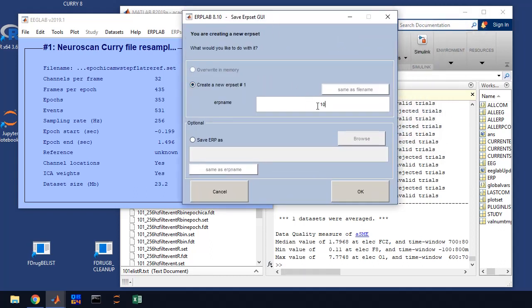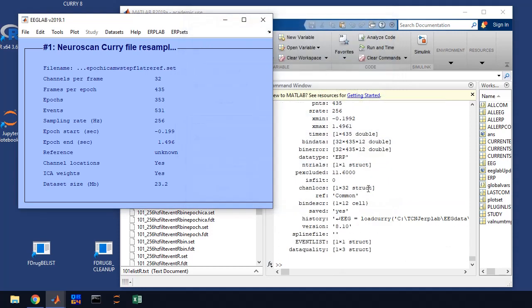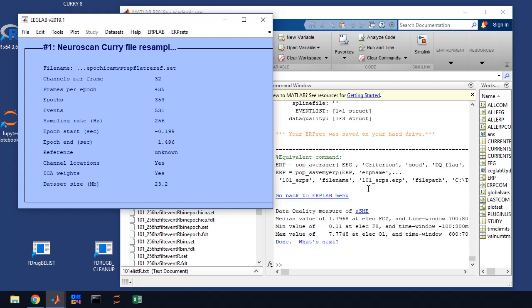Then it's going to ask you to name it. So we're going to name it 101 ERPs, and we're going to use the data file. We're going to save it as the same, so click Save ERP, same as ERP Set Name, and you click OK, and it's been created.